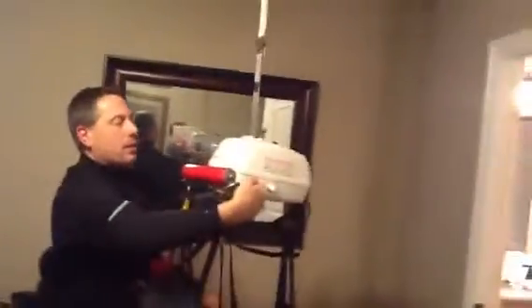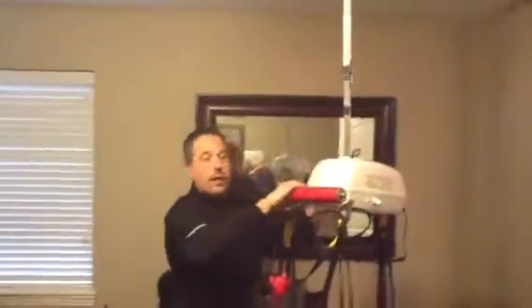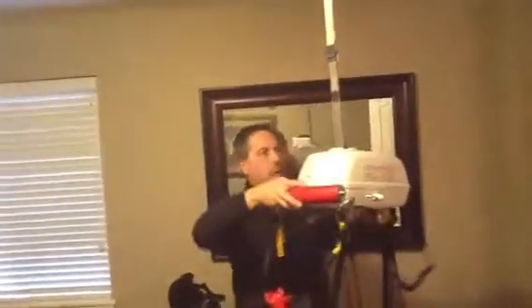I'm going to bring her through this curve here. We have a weight-bearing strap and a non-weight-bearing strap. Notice we're pointing rearward right now. We're going to go through this doorway and transfer underneath this doorway header.